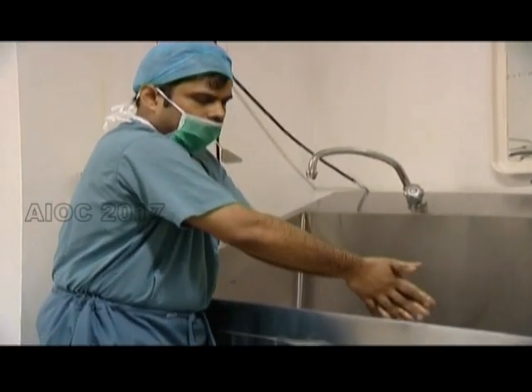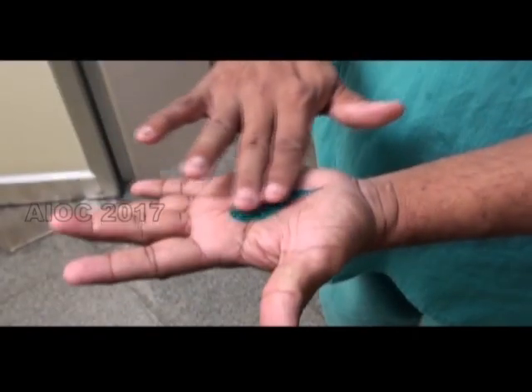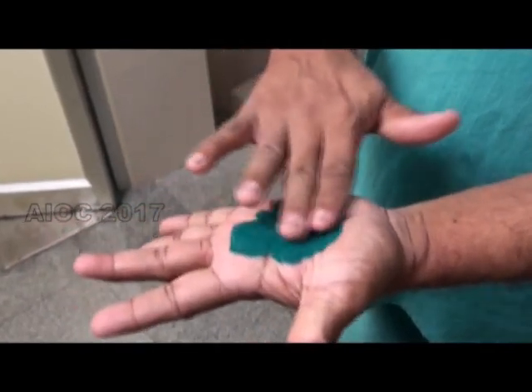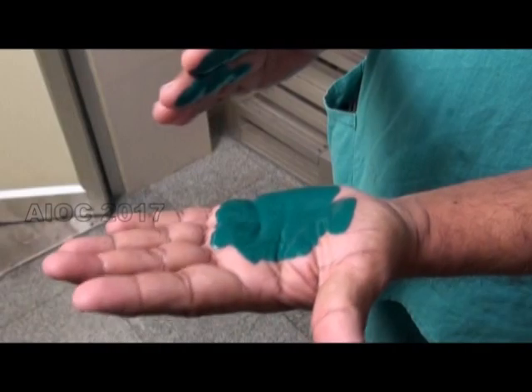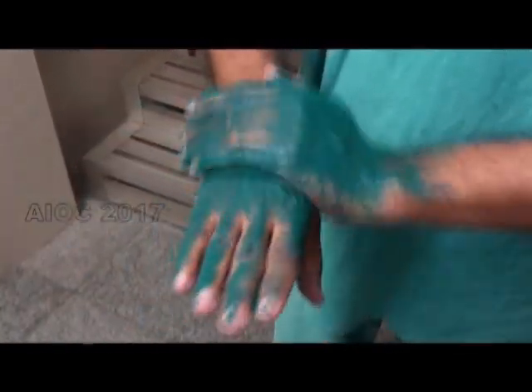Notice the improper way of wearing the mask and cap. We are now going to demonstrate with watercolor to emphasize the need to follow all the steps of the European norm.